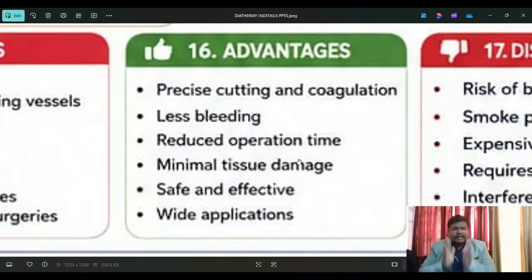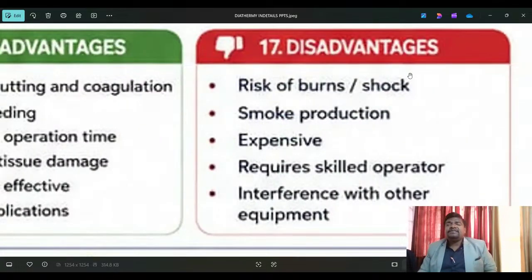At that time, diathermy use and working principle operations are the same. Understand, the features will be different, the manufacturing is different, and the look is different. That's why I'm saying, if you go anywhere, every topic, these are basic common things. Right. Now, the disadvantages are what?